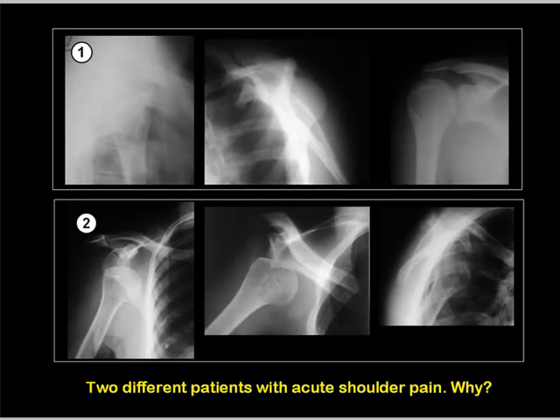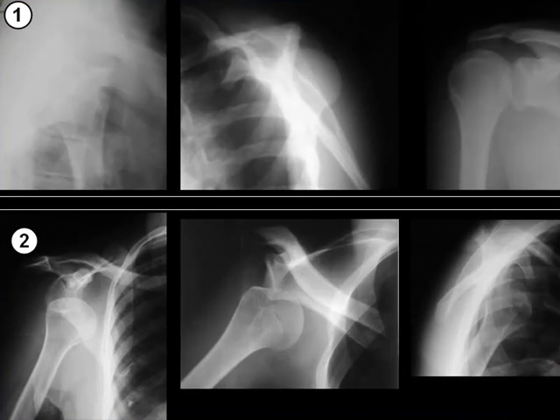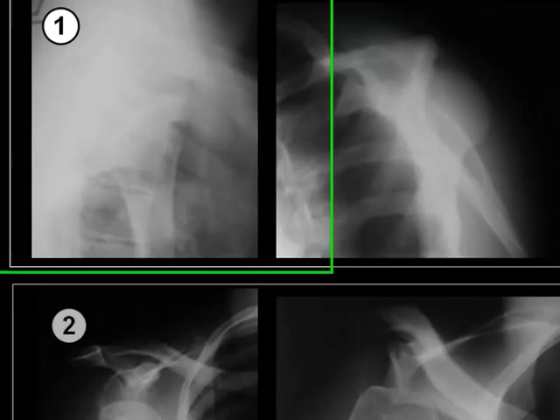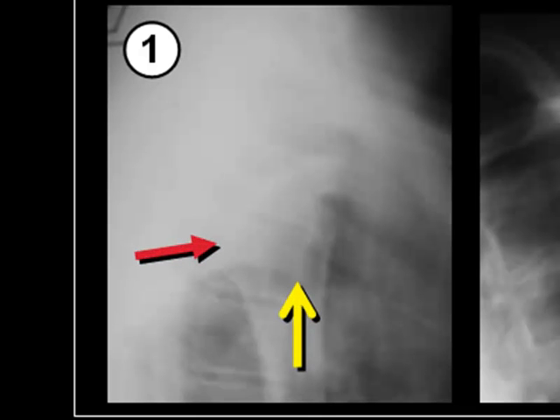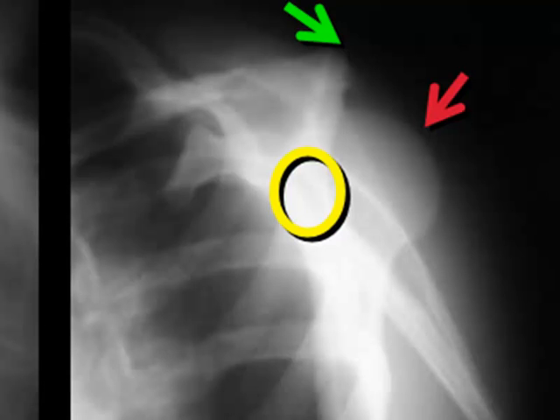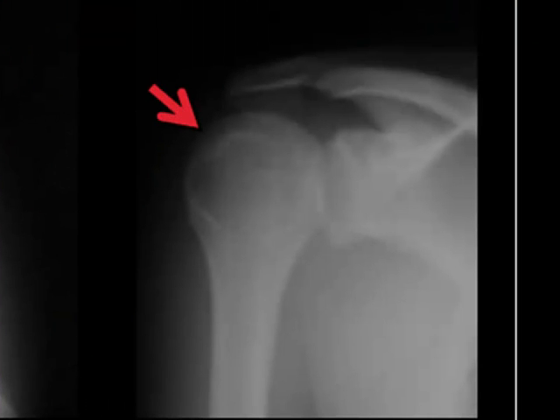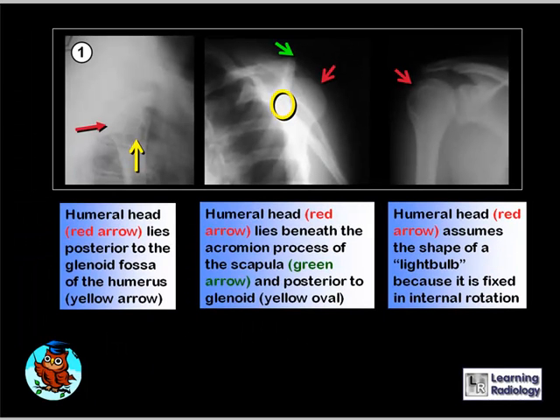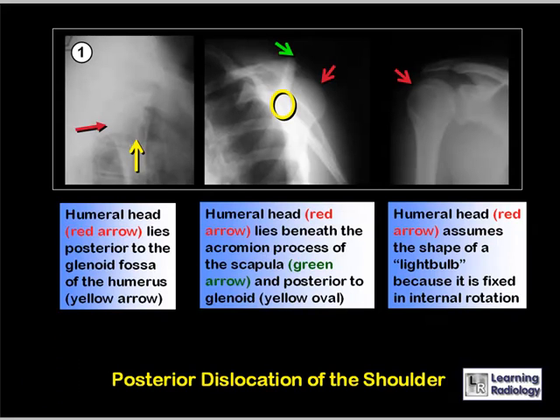Two individuals, both with acute shoulder pain. In patient one, the humeral head (red arrow) lies posterior to the glenoid fossa (yellow arrow). On the Y view, the humeral head lies beneath the acromion process (green arrow) and posterior to the glenoid. On the frontal view, the humeral head has the shape of a light bulb because it's fixed in internal rotation. These findings are characteristic of a posterior dislocation of the shoulder.